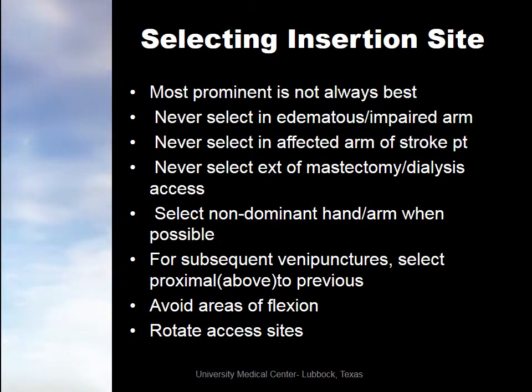The Infusion Nurses Society standards of practice state that the catheter should be the smallest size and shortest length that will accommodate the prescribed therapy.